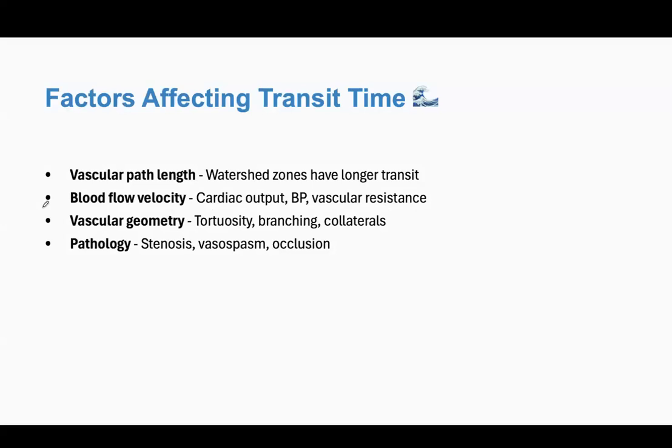We think that everybody has got the same. So depending on the hematocrit also it can change, but in the clinical setting it doesn't matter for the absolute measures.